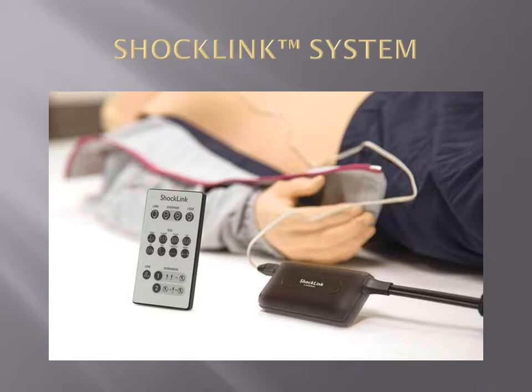ShockLink allows you to use adhesive training pads on your CPR mannequins, and also generates multiple shockable hard rhythms that are the foundation for a solid and efficient CPR/D training program.